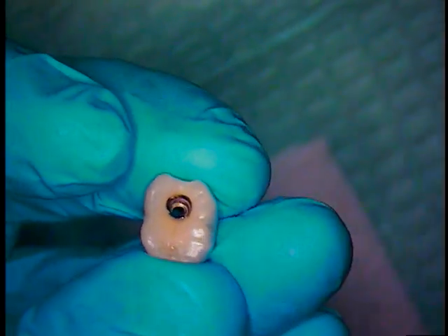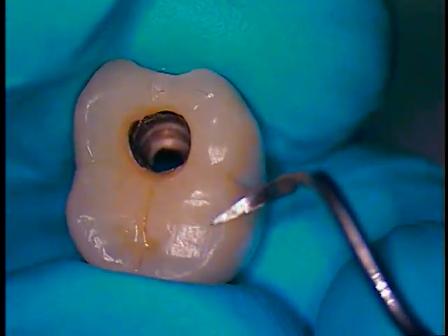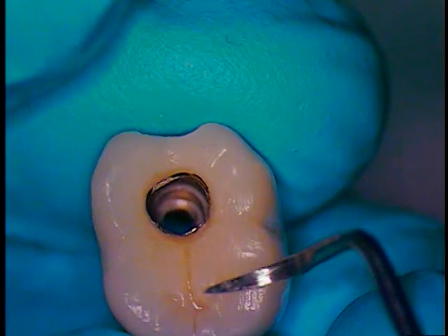So you have to look at the occlusion. It looks like there's a lot of occlusal adjustments that were made on the buccal cusp. If there's a flat occlusion, all the more we have to lighten up the bite. We're going to hang on to the crown and the broken screws. If we can get all the parts out, then possibly we could find another conical abutment that would fit and put all this back together again without having to go through a new crown — that's our wish list. But first we have to remove this plug.